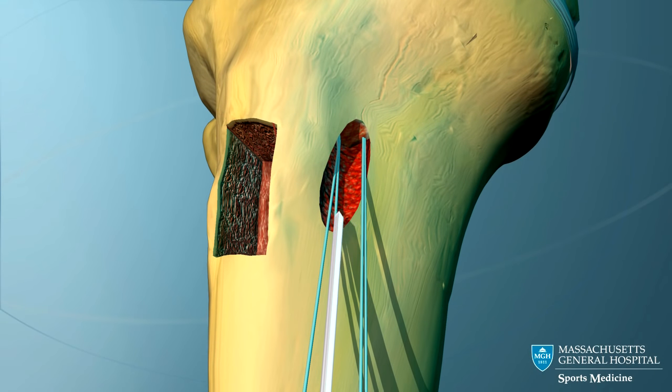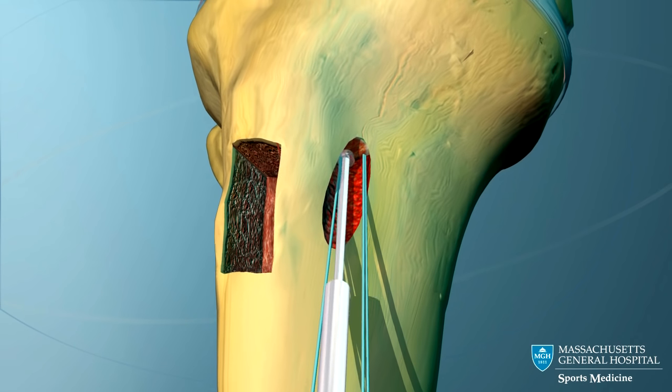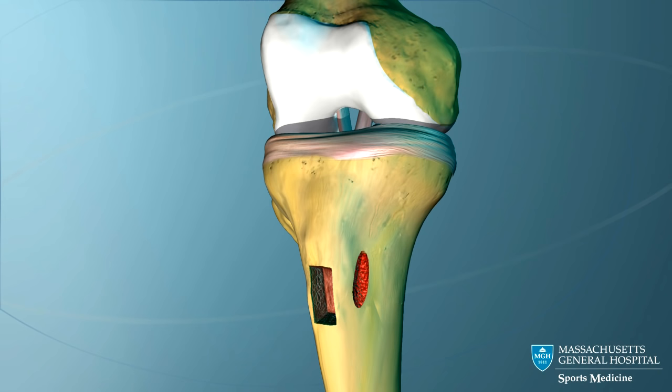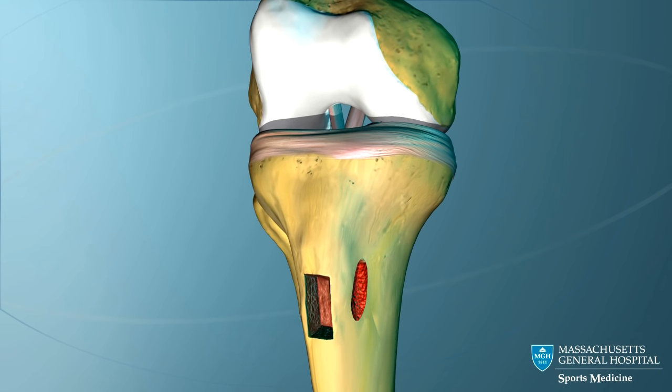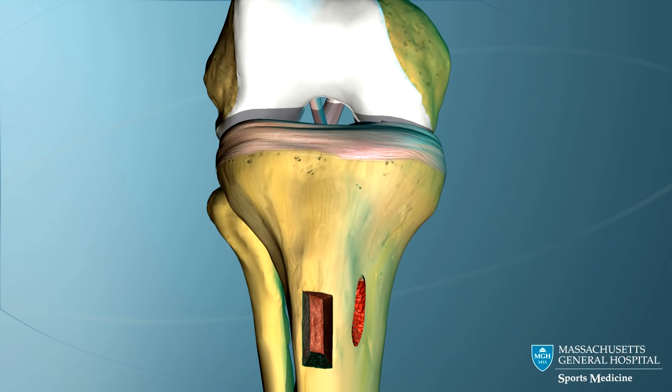As tension is applied to the graft, a second interference screw is screwed into the tibial tunnel. This locks into place the lower end of the graft within the tibial tunnel. The screws securely hold the new ACL in place until the bone plugs heal.